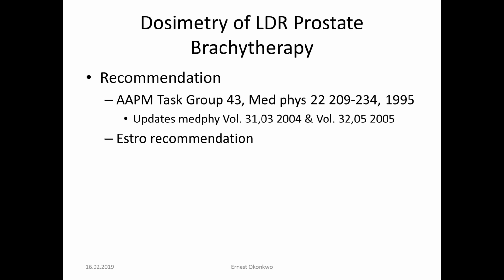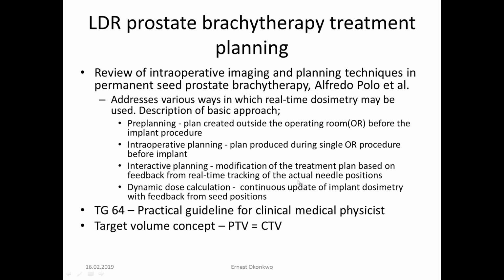Professor Hesser already mentioned a lot of these recommendations, and you also have the recommendation from the ESTRO for the dosimetry of low dose rate prostate brachytherapy, which I'm not going to go into in detail. I'll just jump to the treatment planning of low dose rate brachytherapy, some of the nomenclature that we have in this modality. You have the pre-planning, which is basically a plan created outside the operating room before the implant procedure.